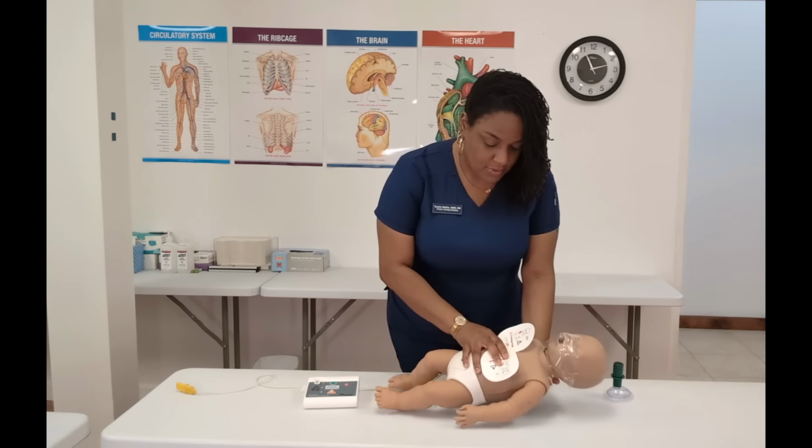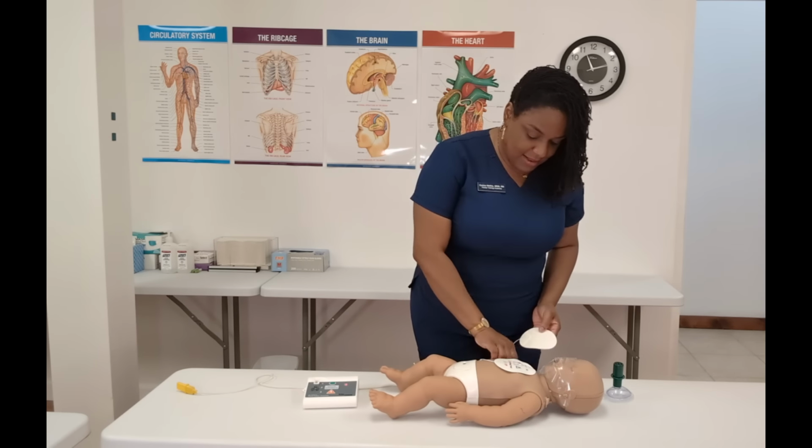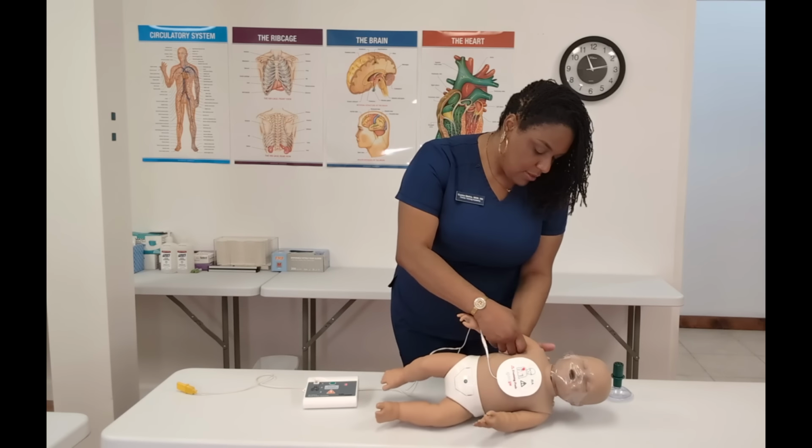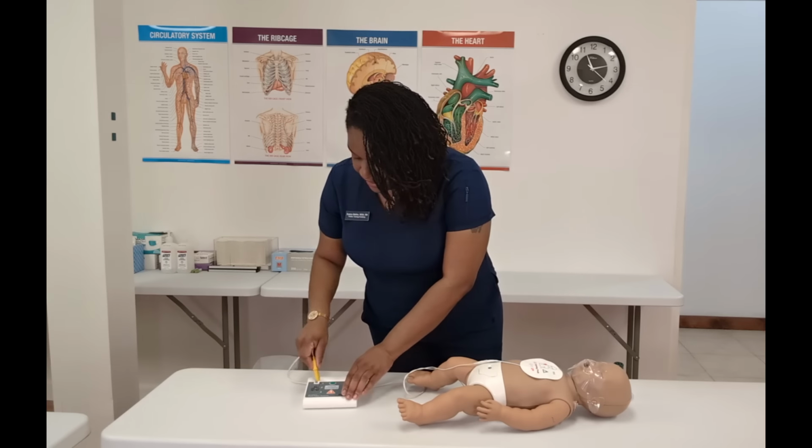So we're going to place one pad to the center front of the baby's chest. And the second pad, center back. I'm now going to insert the connector.